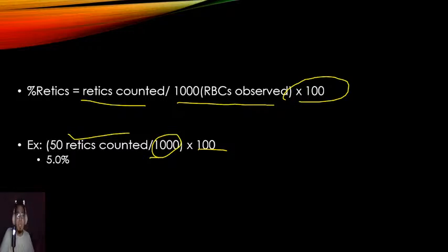And obviously, the patient will not be polycythemic when they request for retics. But there are some cases that some doctors, they will do that retic count, especially for exclusive VIP general checkup, as in lahat papatest. Ang assumption ko is always, estimate ko na lang siya. 100 usually per field ang laman ng isang circle sa akin. For practical to ha, practical.